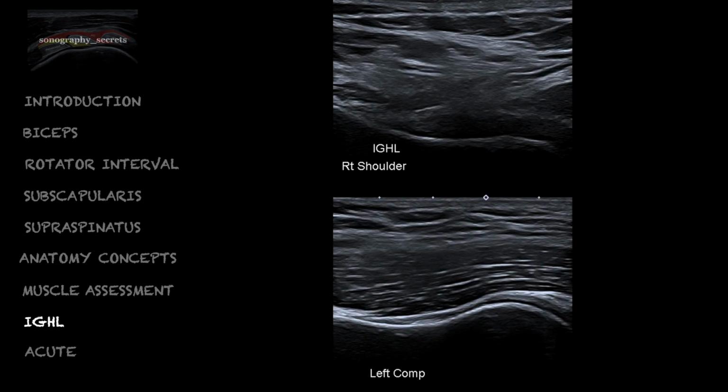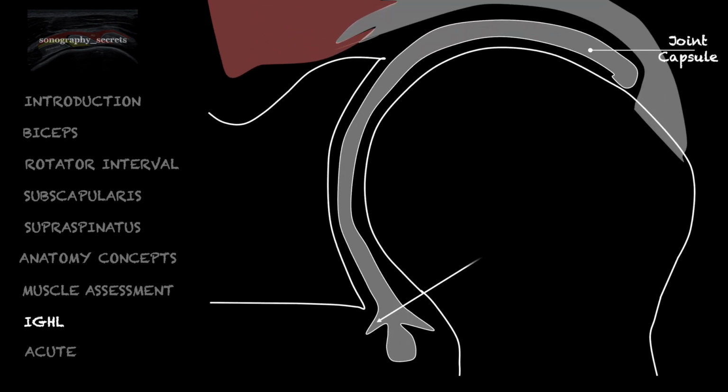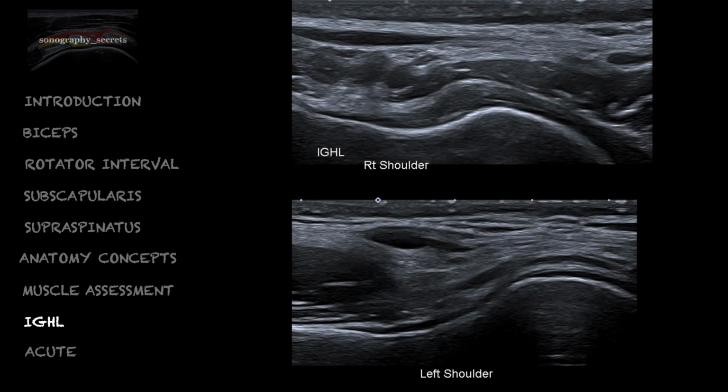However, there is a propensity to put calipers on everything, but like most measurements in musculoskeletal ultrasound, we need to exercise discretion in their applications for a couple of reasons. The first is that we actually have an anterior and posterior inferior glenohumeral ligament, and we can have asymmetric thickening of both of these ligaments. The second reason is that we need to ensure that these findings correlate with the clinical presentation.